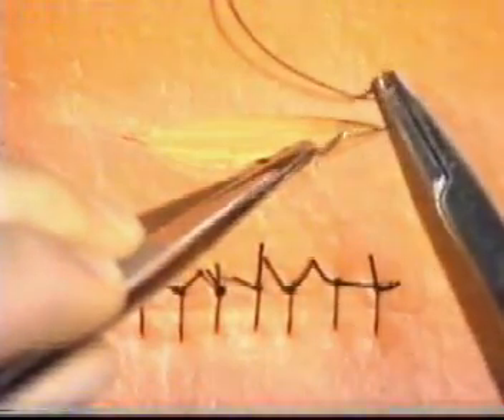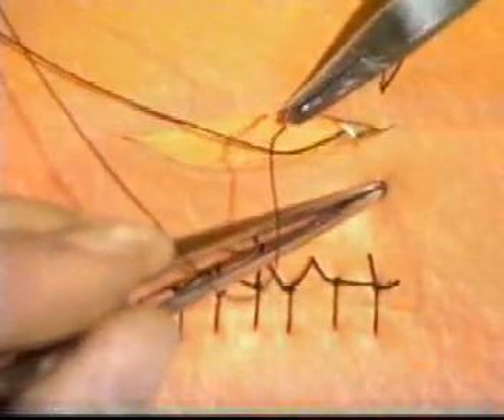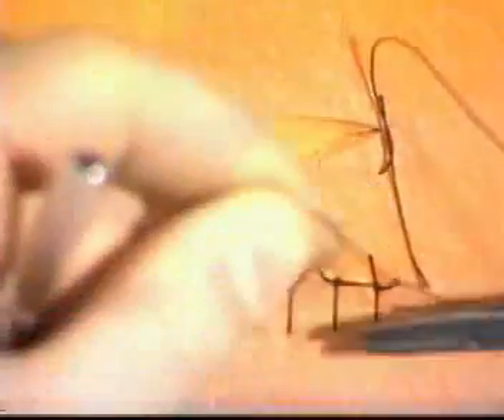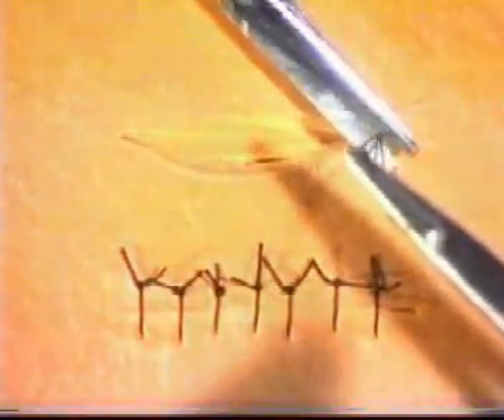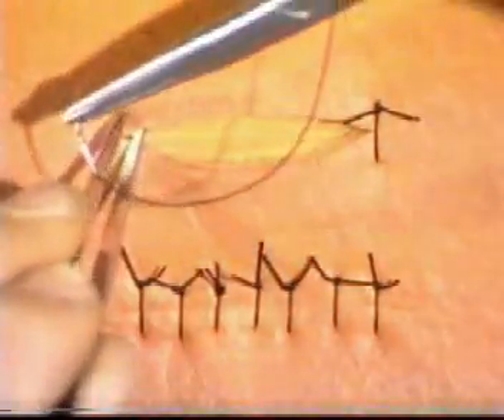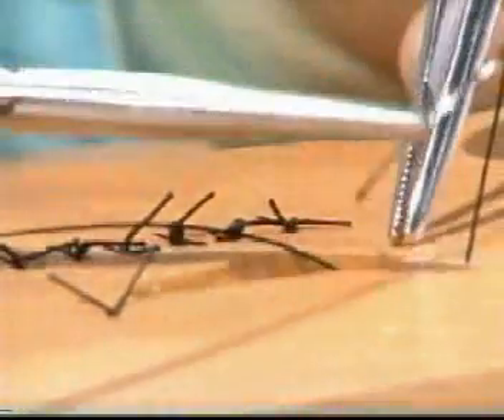In this situation, start at the end of the incision, inserting a suture at right angles and getting right down into the depths of the incision, then come back at the other edge of the skin, again at right angles to the skin edge, and ligate that particular suture. You can then proceed to the other end of the incision and, in a similar manner, insert the suture at right angles into the depth of the wound and then out again at right angles onto the other edge of the incision, and tie a standard reef knot.